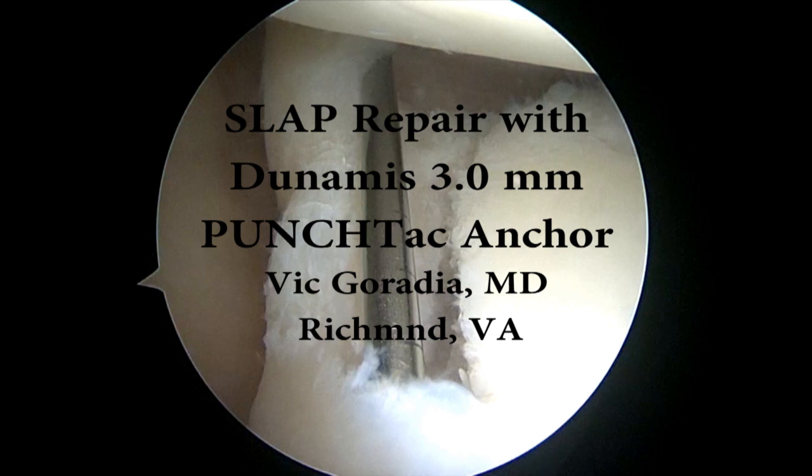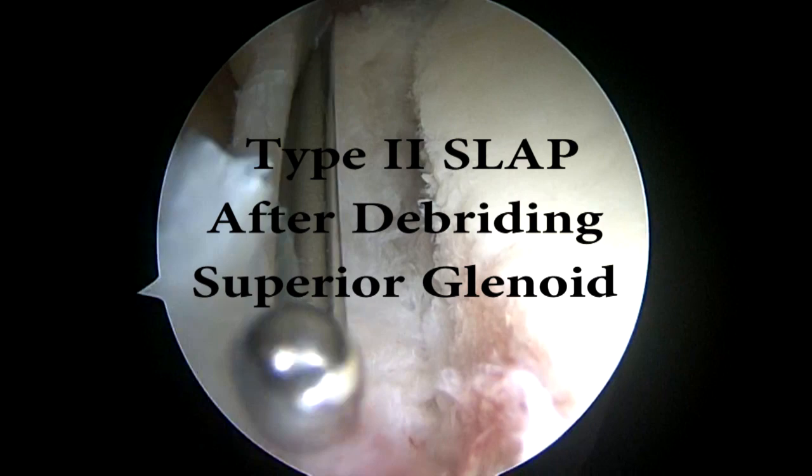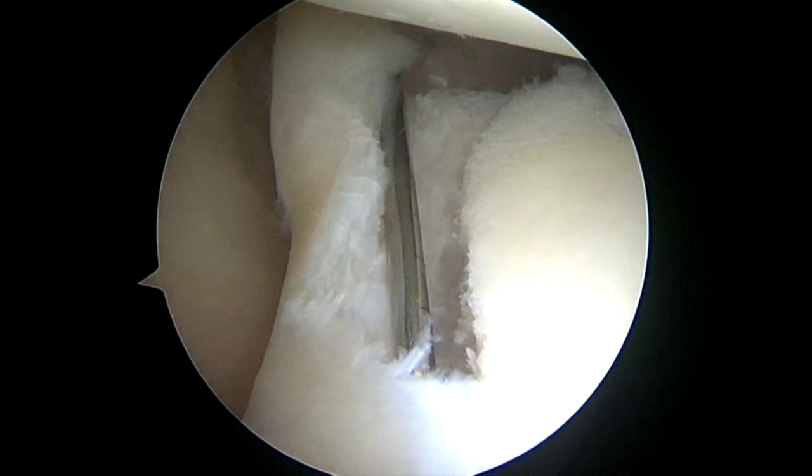This video demonstrates a SLAP repair using the Dunamis 3mm punch tack anchors. We have a type 2 SLAP lesion that you can see after the glenoid has already been debrided to healthy bleeding bone.